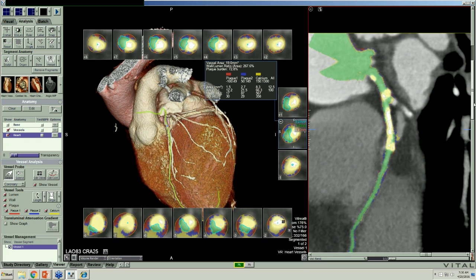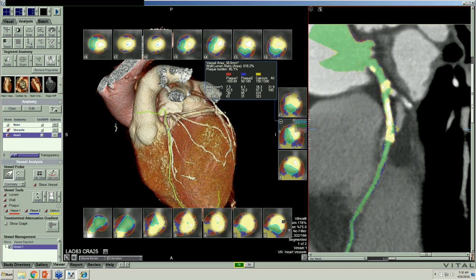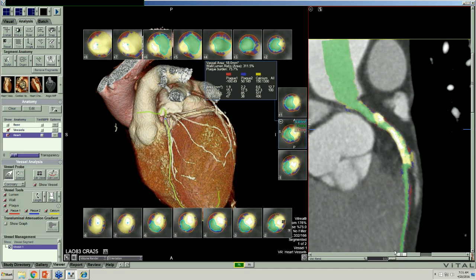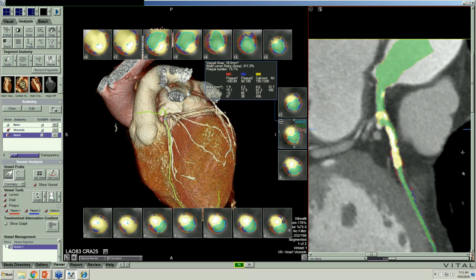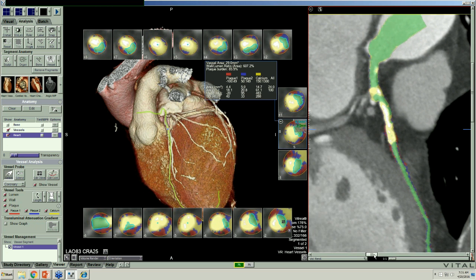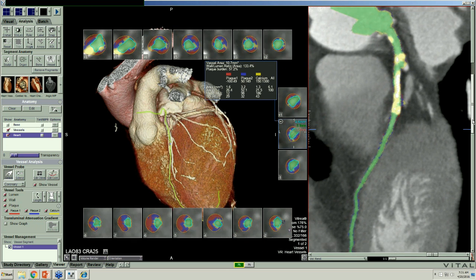And then we're down here, and we can't see the channel coming along. We can't see the channel down here, and then we can see the channel again, and then we can't see the channel. And so a lot of this is called blooming artifact. And so when we get our next iteration of computer post-processing to get rid of noise, we can get rid of some of the blooming artifact and be able to see around it. So we're looking forward to that if we can get the bean counters to buy it for us. And so here we go, looking at this.